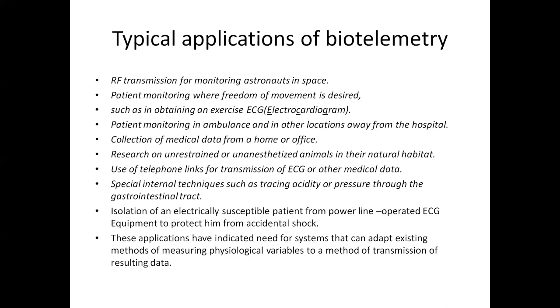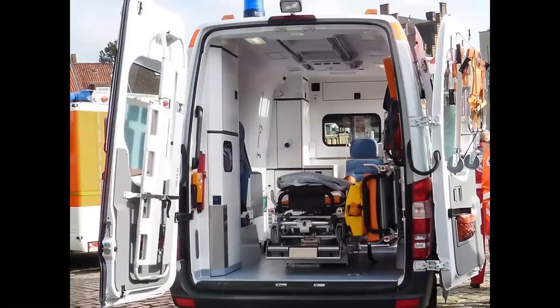So use of the telephone links for transmission of ECG or other medical data is available. Special internal techniques such as tracing acidity or pressure through the gastrointestinal tract. So these are several applications of biotelemetry in a simple manner. This is a good example for biotelemetry, which is used for ambulance services, 104, 108, etc.